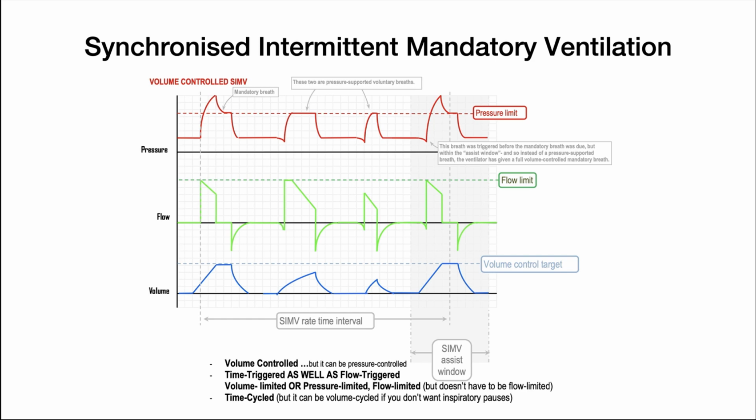When a patient is deeply sedated or paralysed, SIMV functions pretty much like an ACV mode. The patient receives a fixed number of mandatory breaths as determined by the set respiratory rate with a set tidal volume, PEEP and FiO2. However, if they're generating a spontaneous ventilatory effort, then SIMV will assist the patient when a mandatory breath is triggered and support spontaneous breaths above the set number of mandatory breaths required. The advantage of this mode is that it allows the patient to receive a fixed number of mandatory breaths by controlling the breaths or assisting the breaths if the patient is triggering the start of the inspiration, and the patient is allowed to breathe spontaneously at a higher frequency than the set rate.